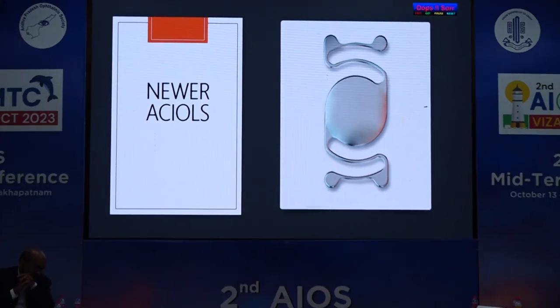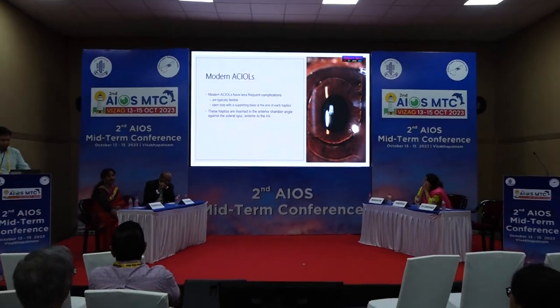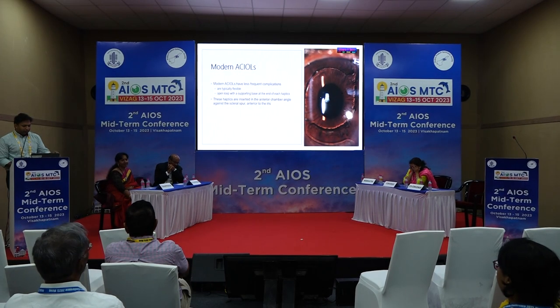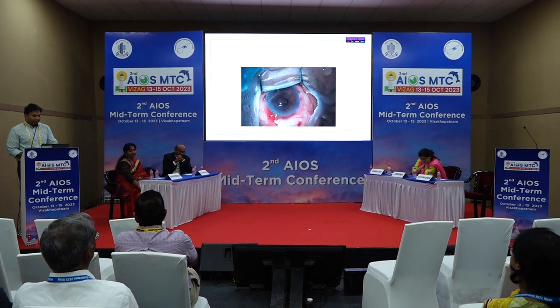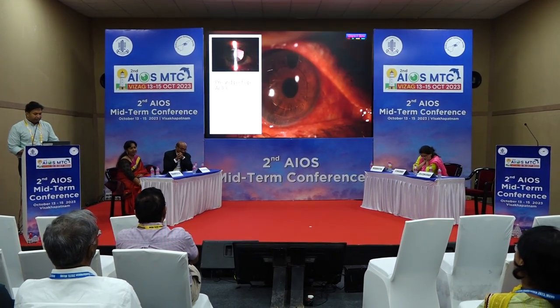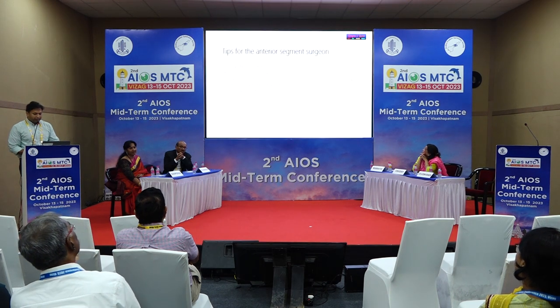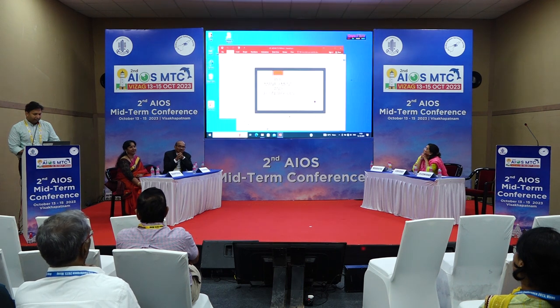And I also want to tell that ACIOLs are not a bad option, whatever works in your hands. Previously, ACIOLs were contraindicated because they led to pseudophakic bullous keratopathies. But if you do a good PI and a good vitrectomy, ACIOLs also do very well. So do what works in your hands, like Dr. Ravikumar Reddy sir said, under promise and over deliver. Thank you.